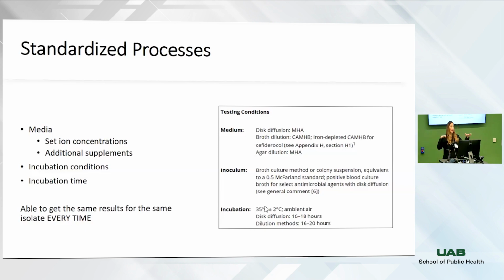So across clinical labs as a whole, across the country, and even in a lot of European healthcare centers, we all use the exact same process to test antimicrobials. So we use the same medium. So there's actually books, multiple volume books that go into this. And we all use the same medium to put our bacteria on. We all use the same concentration of organism.